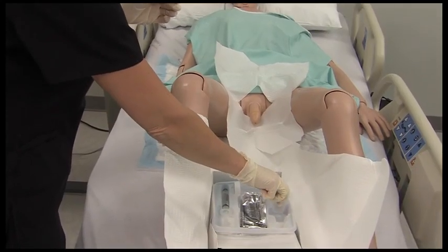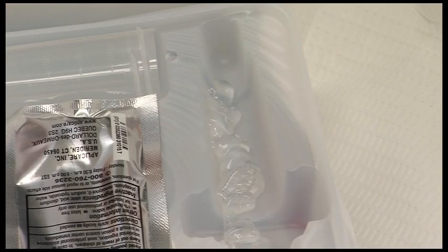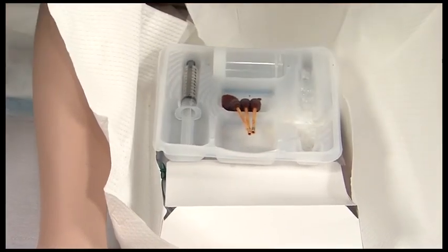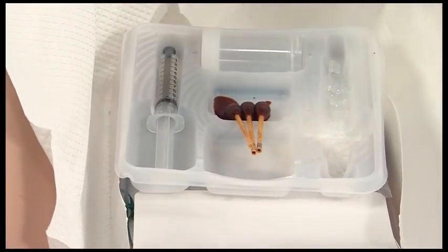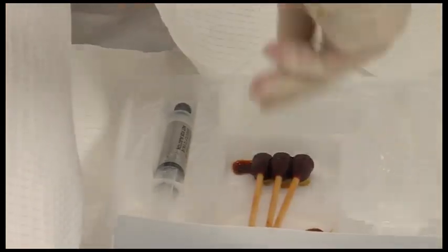Locate the green syringe with lubricant and deposit the full amount of lubricant into the tray. If hospital policy permits injecting lubricant into the male urethra, full amount will not be dispensed at this time. Open the packet of pre-saturated povidone iodine swab sticks. Remove the top tray and place it next to the bottom tray, keeping both on the outer wrap.